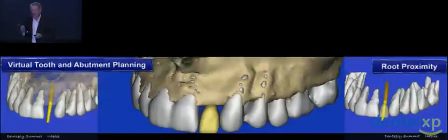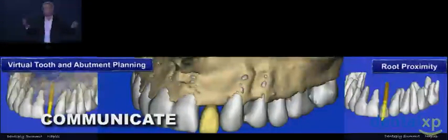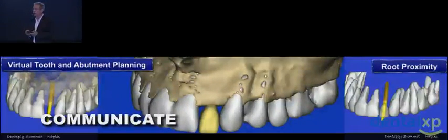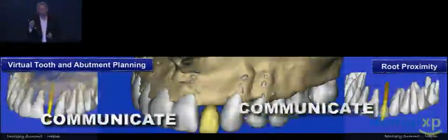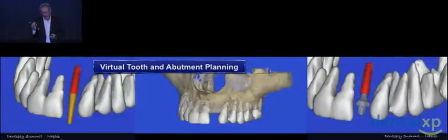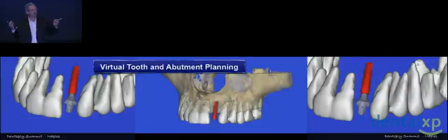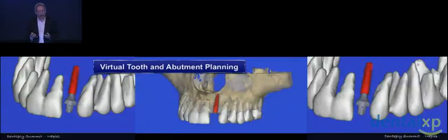And so having that capability to be able to communicate these ideas with all of our partners, including our dental laboratory technicians, as Marcus very nicely alluded to earlier, allows us a tremendous communication process. So this is where we are, and this is how we can do not only virtual implant planning, virtual abutment planning, and, of course, utilizing a virtual tooth, a virtual wax-up that we can convert at some later date to CAD/CAM related issues.